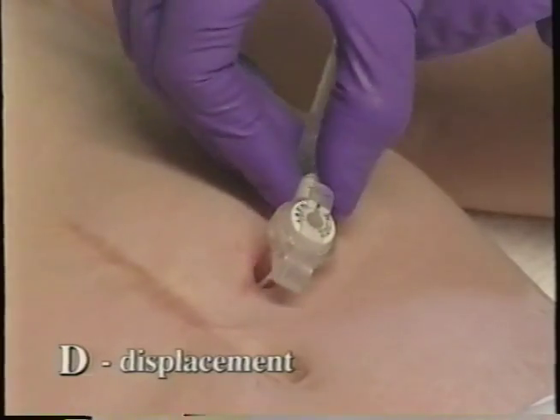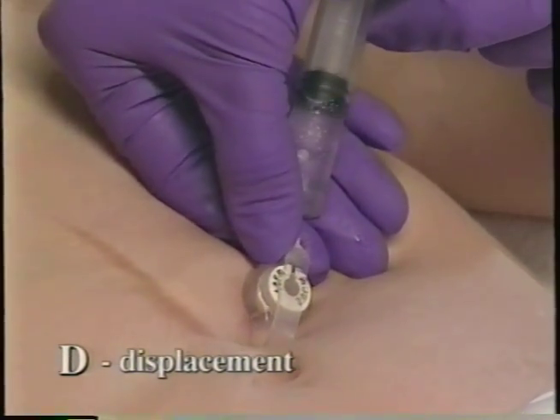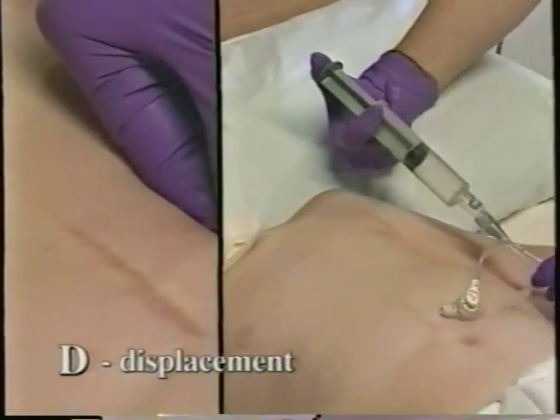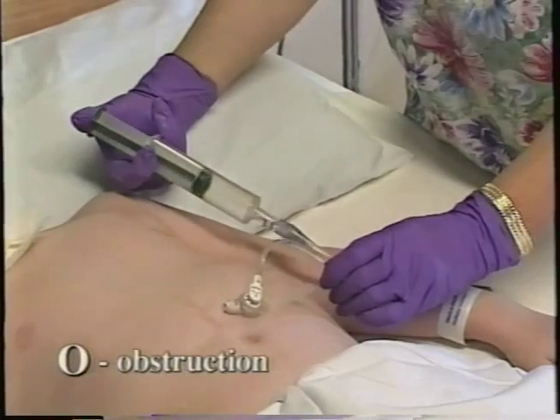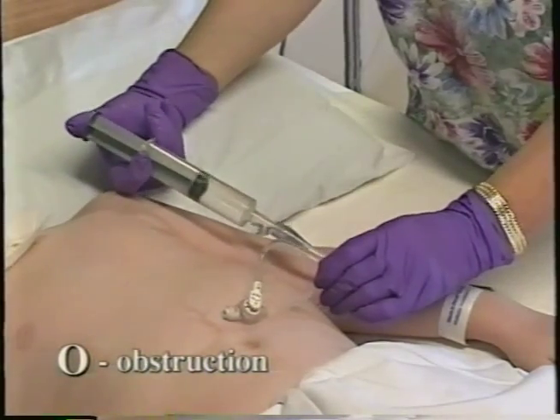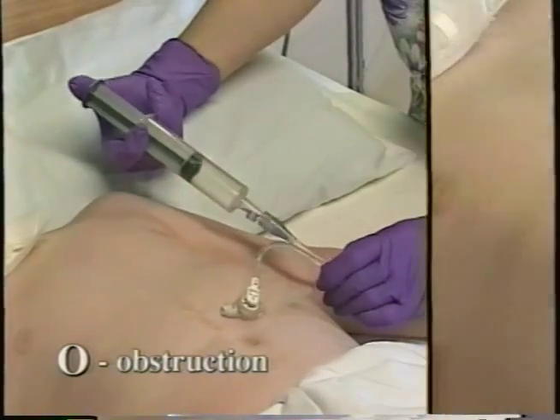D is for displacement. Is the feeding tube dislodged? Surgically placed tubes that are dislodged need to be replaced to avoid stoma closure. O is for obstruction. Is the tube obstructed? If the obstruction cannot be cleared by flushing the catheter, tube replacement may be necessary.